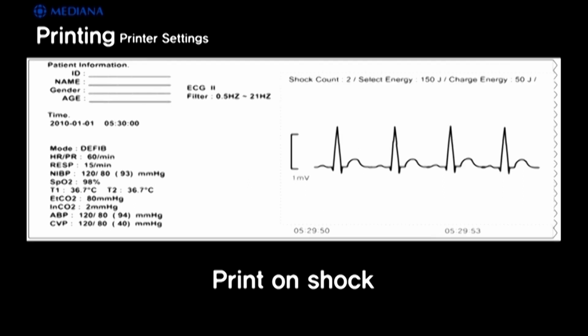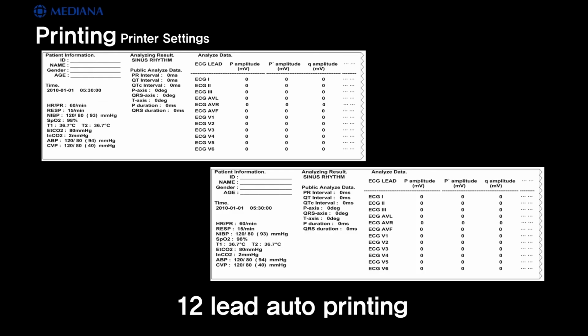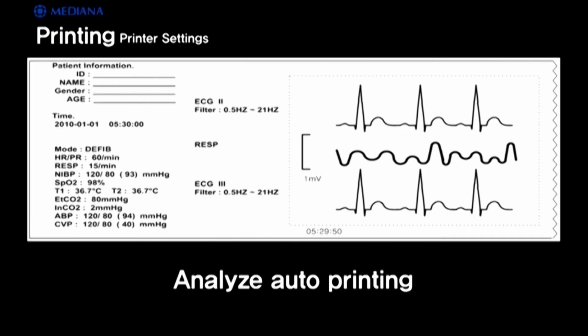When print on shock is set to on, the D500 will automatically print out information 10 seconds before and after a shock is generated. If 12-lead auto printing is set to on, the D500 will automatically print out after a 12-lead ECG is acquired. When Analyze Auto Printing is set to on, the defibrillator monitor will automatically print out analyzing data for 10 seconds after starting the analysis.